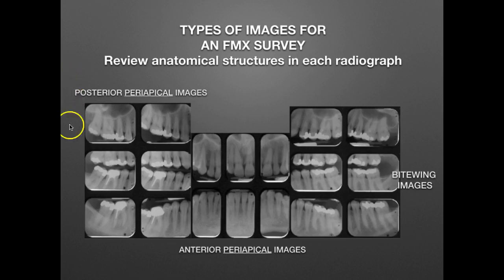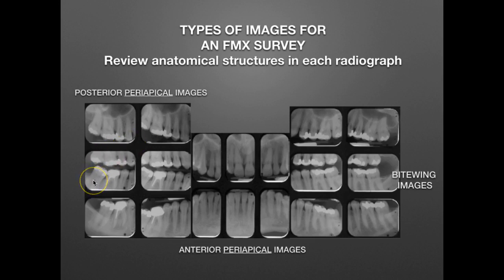Here is a typical FMX survey or FMX series. It has 18 images, and we want to review the anatomical structures in each radiograph so that you know what the dentist is looking for as we take and evaluate our images. Typically there are periapical images posterior for a molar and a premolar in all quadrants, then four bitewing images, and anterior periapical images for the maxillary and mandibular anterior teeth.